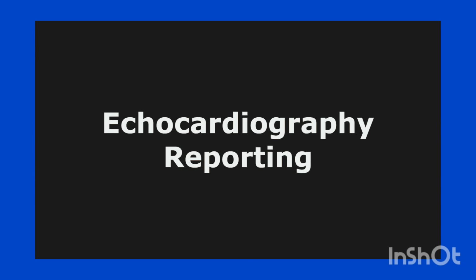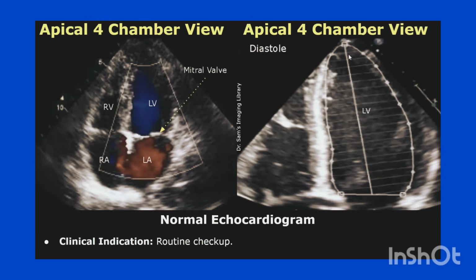Echocardiography reporting. You will learn how to write echocardiography reports for various cardiac pathologies. This will mainly include the findings and the conclusion.